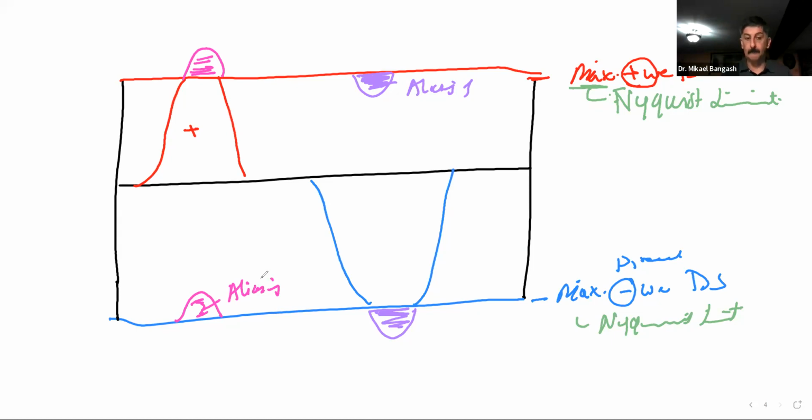Is that clear? The call goes in chapter 21, or chapter 20, sorry, where we may see positive Doppler shift, aliasing or not. What you normally will have is a slight negative Doppler shift like this.